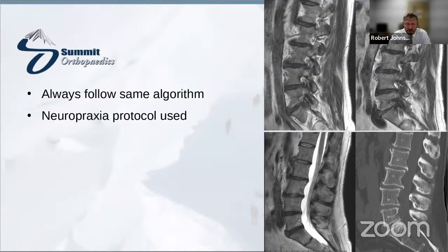And we had the discussion. We said, hey, we may not be able to get to the L1-2. He's obviously having some issues. You have some anterior osteophytes there. He is starting to collapse. He's still fairly hydrated, if you will, but he's not as bad as the lower 4.